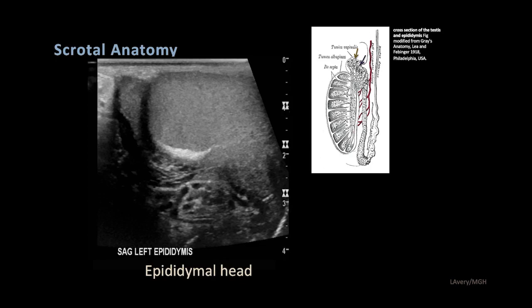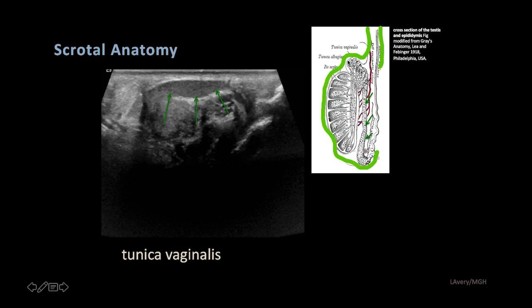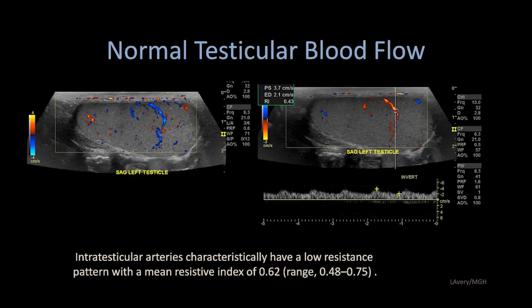Exiting the testicle, we come to the epididymal head — a nice triangular appearance, homogeneous in echo texture, extending down into a very thin, narrow epididymal body and tail. The entire epididymis and testicle are invaginated in the tunica vaginalis, which is a reflection of the peritoneum as it descends through the inguinal canal. Normal testicular blood flow shows normal, low-resistant blood flow within the testicle, with maintained diastolic flow throughout the entire cycle.